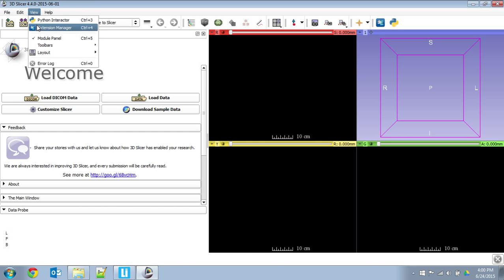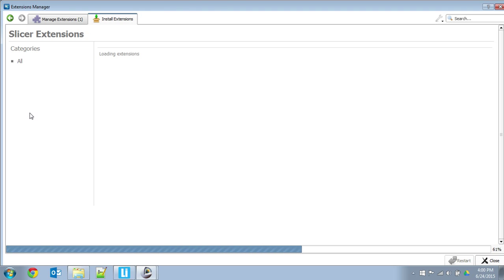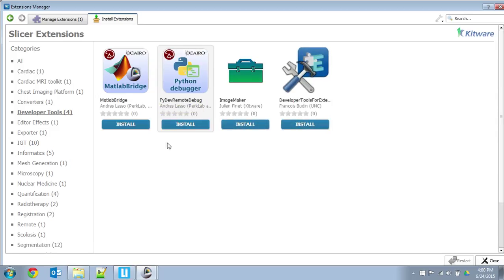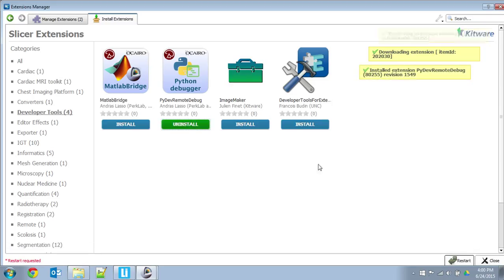I'm going to go to the Extension Manager and install, under Developer Tools, the PyDev Remote Debugger, also written by Andras Lasso. Okay, and now I'm going to restart.